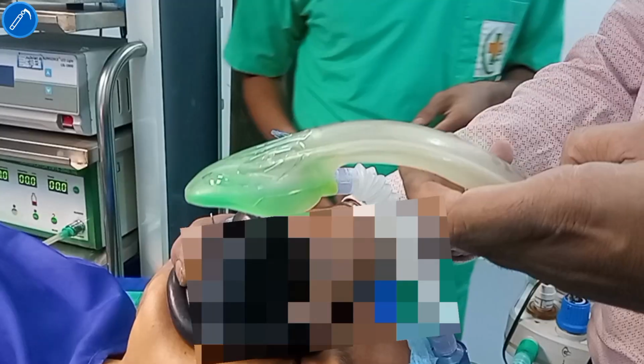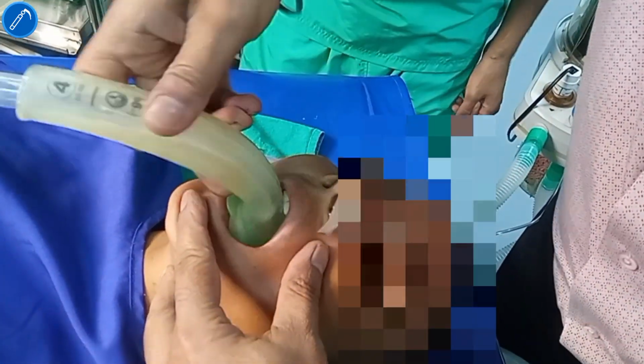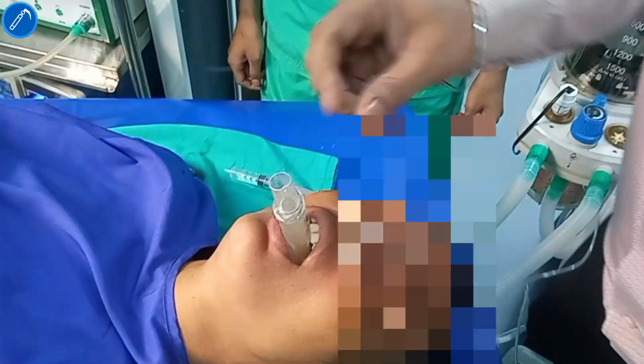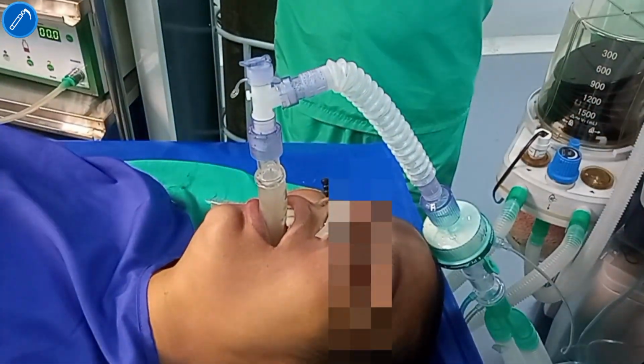Now after slight mouth opening, we will insert the iGel. You can see in the video. After properly inserting and ensuring its proper position, we will connect this iGel with the ventilator circuit. So this is the proper technique of inserting an iGel.